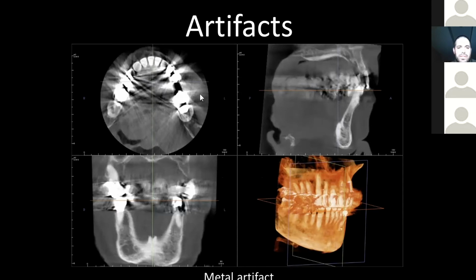Now, some cone beam CT makers are advertising and promoting some metal artifact reduction approaches. There's validity to those. What they can do is reduce some of the smudginess here, but what they're really not doing is reconstructing the raw data properly. And also what they can't do is get at what I call some of these near field artifacts right next to the metallic objects. That data is corrupted and lost. And at this time, we can't fully calculate for that loss of information. So we just have to deal with it.